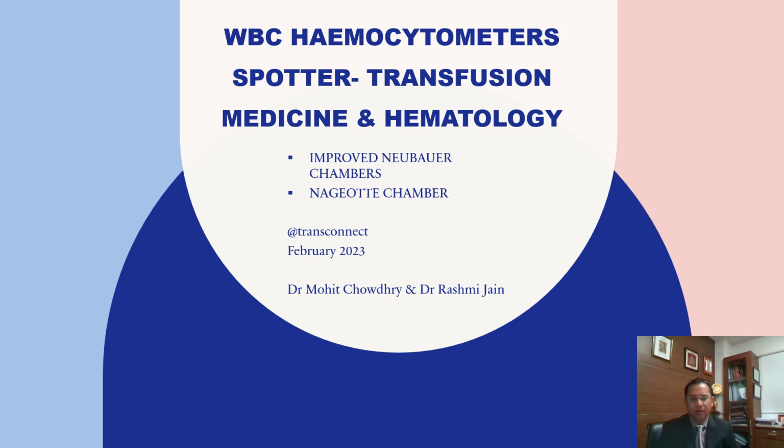Good morning, everyone. I welcome you all for this new episode on WBC hemocytometers, which is a spotter in transfusion medicine, in hematology, in laboratory medicine. You will come across this hemocytometer somewhere or the other, and it is a very simple spotter, but you need to master it, and that's how you're going to score the point in these spotters.